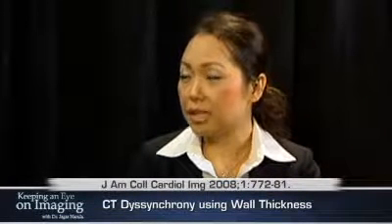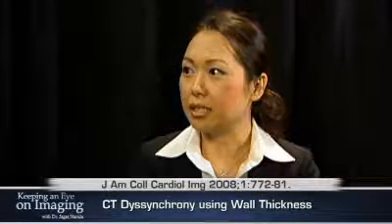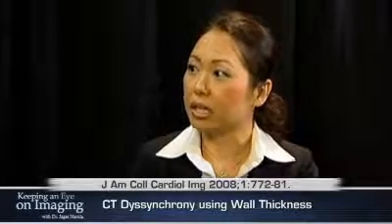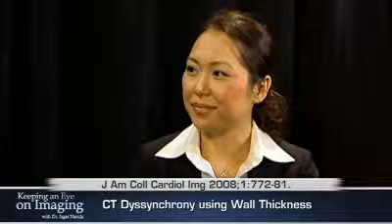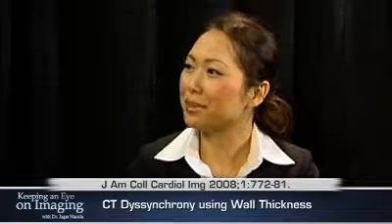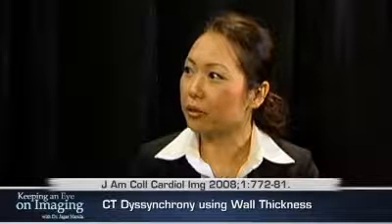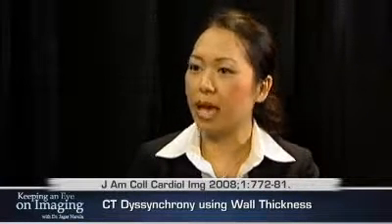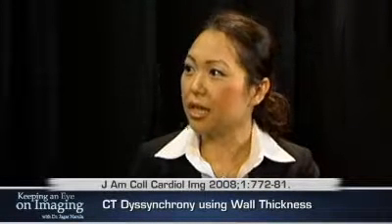Mm-hmm. The advantage of CT is that you can simultaneously also get the coronary veins. And this might be very helpful for the electrophysiologists as they're planning their lead strategy. Absolutely. Sounds almost like a one-stop shop for heart failure by doing CT. Yes. Unfortunately, there is no one-stop shop right now, but I think as we continue to work on the research and develop more software algorithms and the CT scanner improves in terms of its temporal resolution, it may be.